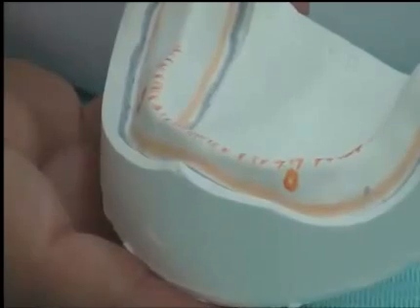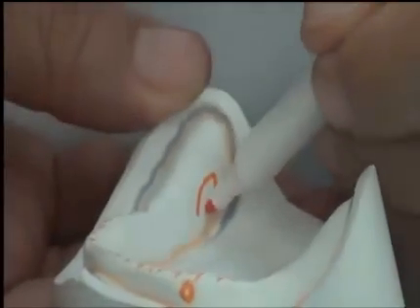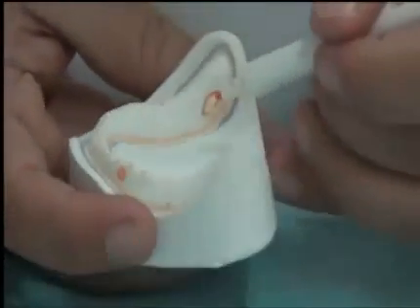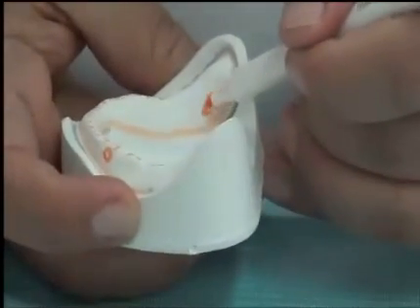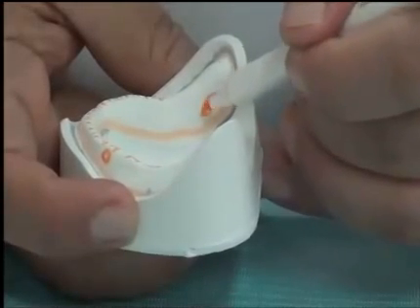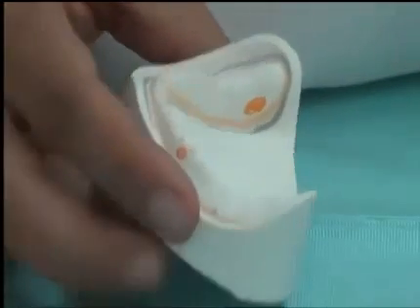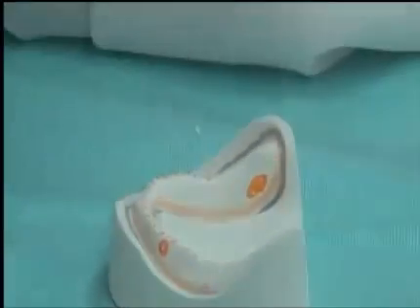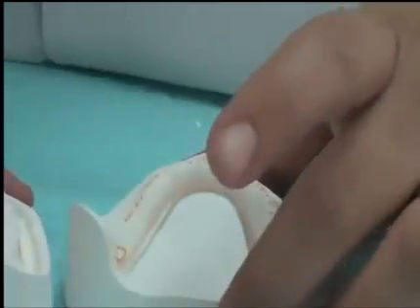In many cases, the places where we usually face the undercuts are around the lingual pouch from the lingual distal area. Sometimes we have undercuts. If we have the issue of undercuts and bulbous exostosis before this undercut, it will be covered by thin mucosa and we should relieve them. So these are the areas of relief and supporting the upper and the lower.